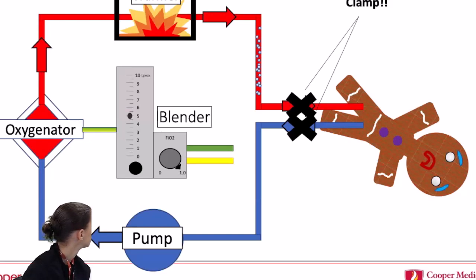The other thing is, if you have an event like this, where is the negative pressure portion of the circuit? On the drainage side. The drainage side up until where? Up until the other side of the pump, correct. So here to here is going to be under negative pressure, because this is spinning, it's pulling blood this way. So if you have a bunch of air in the circuit, you're going to clamp off and run your circuit, but your eyes should start at this section here. Because if you poke a hole in here, where there's an opening connection, air is going to get sucked in. If you poke a hole anywhere here, it's going to squirt out. Blood loss.